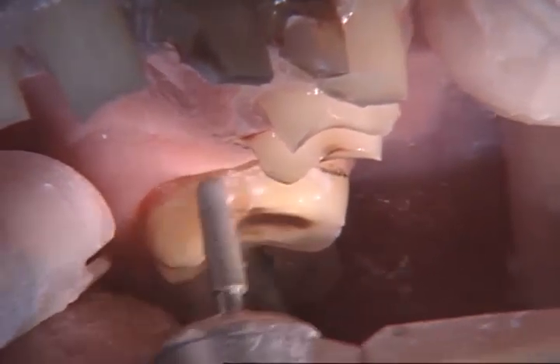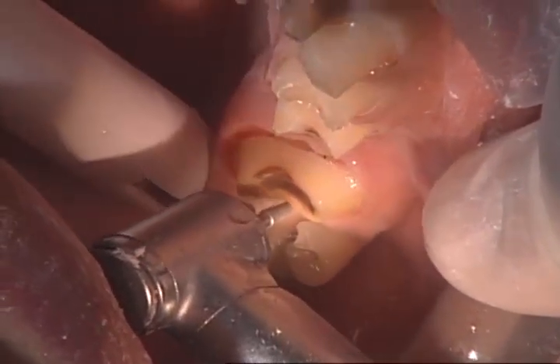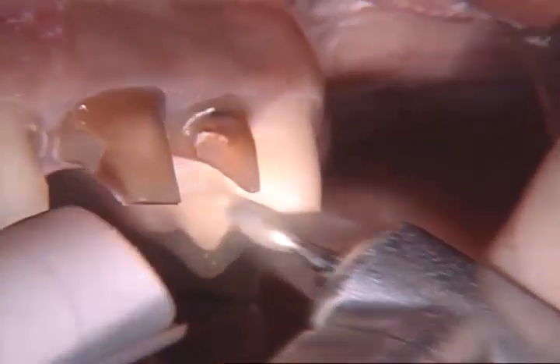Interproximally, the margin's just a little bit different, but that's actually desirable from a resistance standpoint. We don't want to cut the exact margin all the way around the tooth and round off the tooth, because then the crown is able to spin in a mesial or distal direction. We do, in fact, want a nice margin on the facial and lingual with it slightly thinner interproximally, following the shape of the tooth.